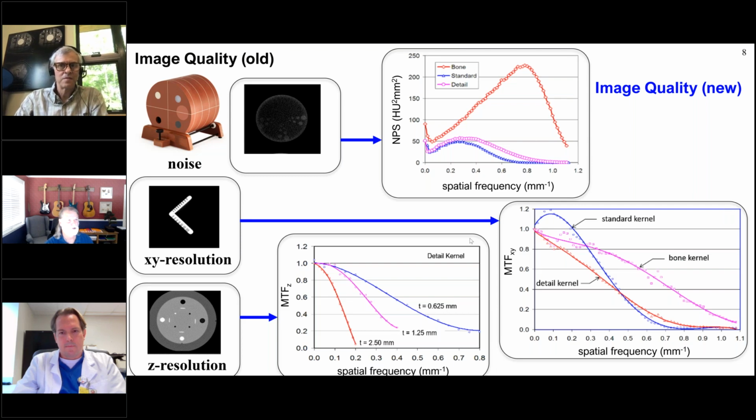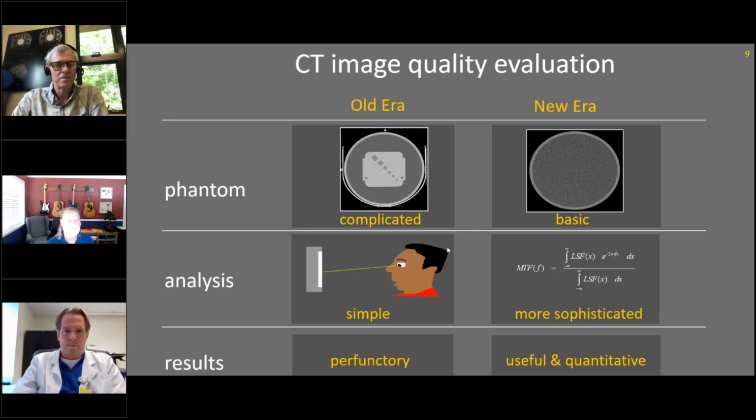In fact, most state laws require that you use the old metrics. And so it's been a little bit fighting tooth and nail to get newer, more modern quantitative standards in with whole body. But we're at the precipice of standards for CBCT, so we can enjoy these new quantitative metrics now as we develop the standards for that. So that's what I find to be very exciting. And I think I've conveyed what's on this slide. So maybe we could move to the next one.